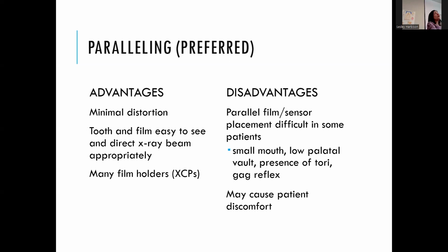Or saying, I know that this is uncomfortable, but if you relax your tongue or you just let me place it, you kind of give them a little head start. Like you may feel this a little bit, but if you can just hold it for a few seconds, I'm running in and out of the room real quick. You talk them through it. And you guys who've had experience know that talking your patient through it is sometimes 90% of it. And if they know that you understand what they're going through and you're not just saying, just tough, live with it, you kind of talk them through it, they'll tolerate it a little bit better.